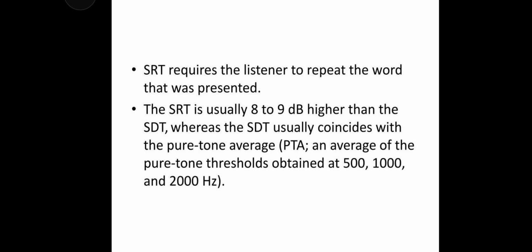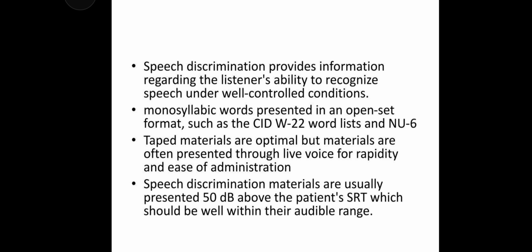SRT requires the listener to repeat the word that was presented. The SRT is usually 8 to 9 decibels higher than the SDT, whereas SDT usually coincides with the pure tone average. Pure tone average, an average of the pure tone thresholds obtained at 500, 1000, and 2000 Hz.